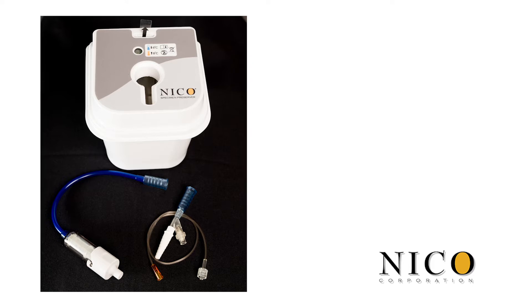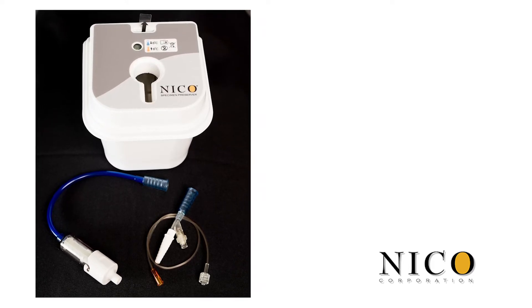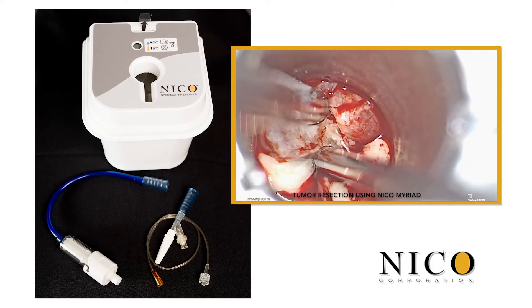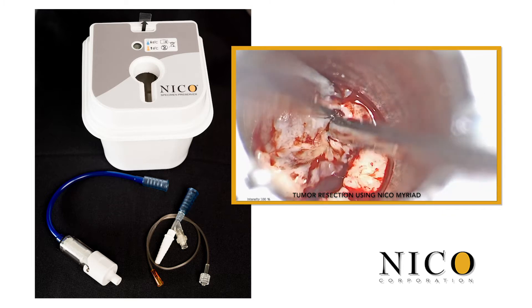Today we will review the NICO Automated Preservation System, exclusively for use with the Myriad Novus Resection Device. This combination provides non-ablative, non-thermal resection with automated collection and biological preservation of tissue.